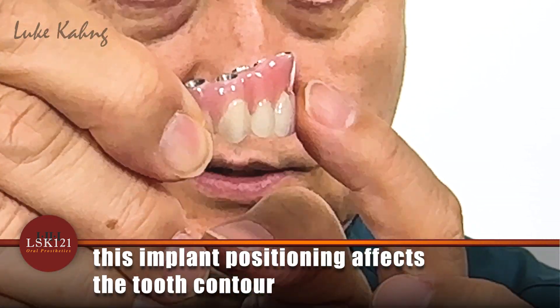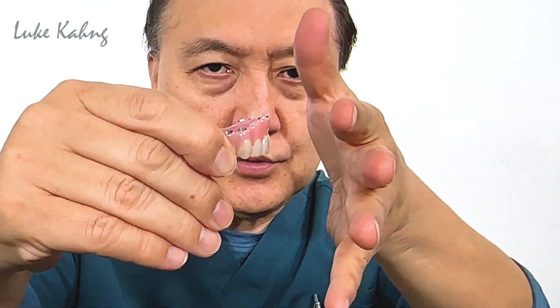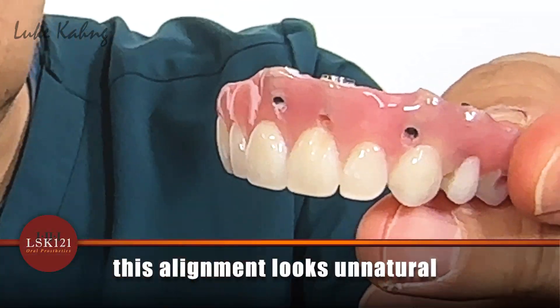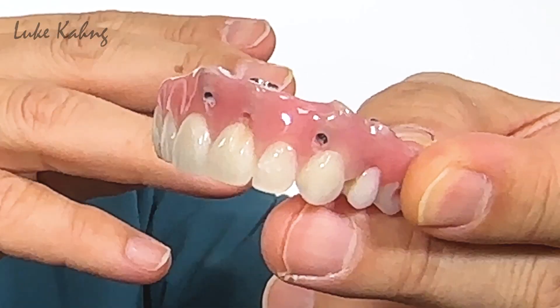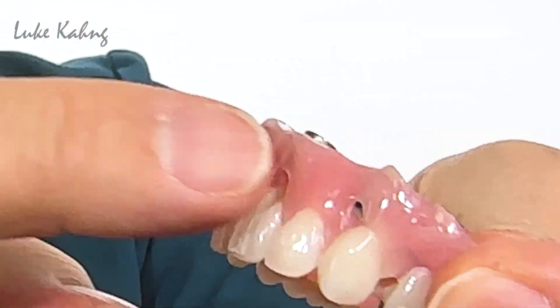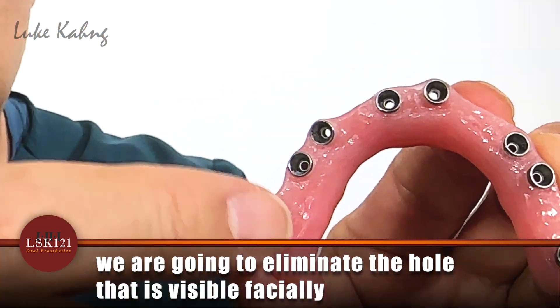Here's the tissue, here are the teeth, and we're trying to line it up. The alignment between the tissue and teeth looks unnatural, so we wax up and then give the dentist a digital design. We're trying to build up the facial area to eliminate the facial hole.